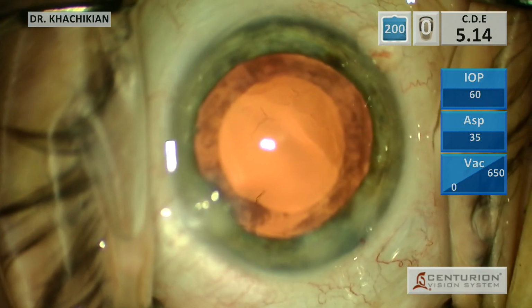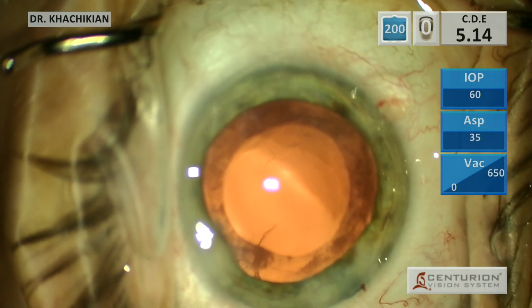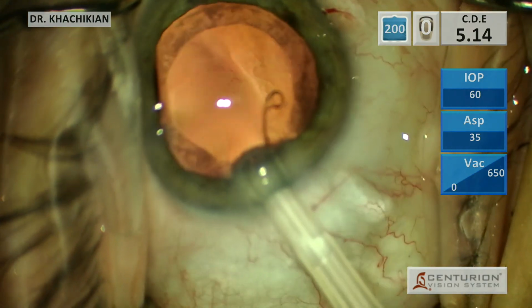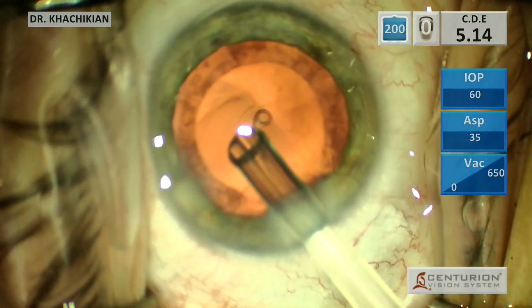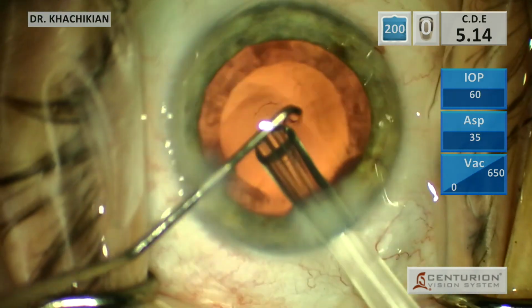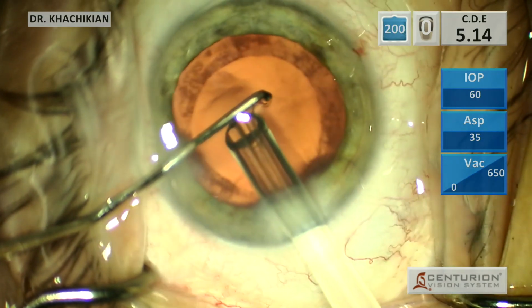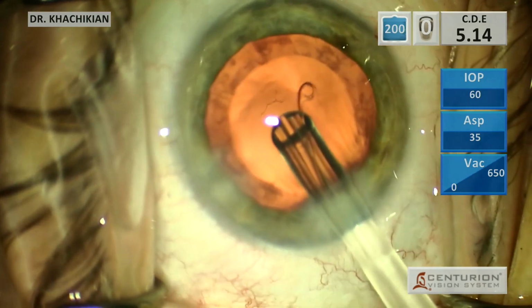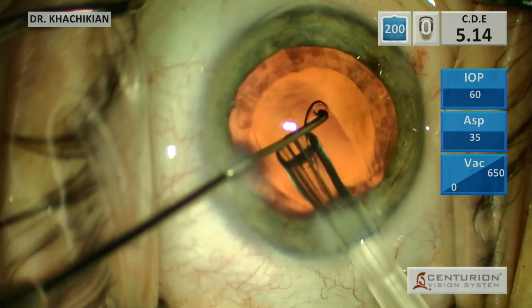There's a few different ways of putting in capsular tension rings. For this example, we're going to be using the injector, but you can put them in without an injector and just manually load it. What I usually try to do is, I'm right-handed, so I have the capsular tension ring going to the right, and I try and hold the tip with either a second instrument or a Sinskey. This second instrument has a little ball on the end, so it's too wide. So we're going to take a Sinskey hook.